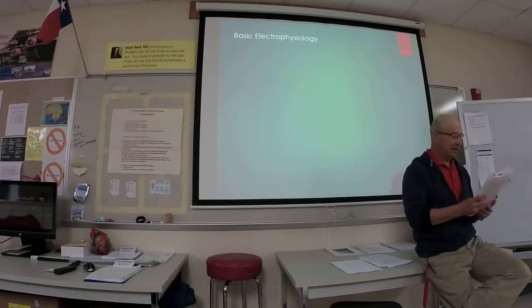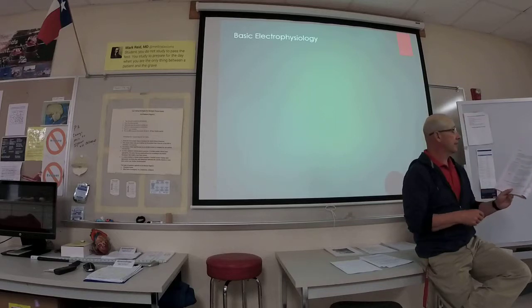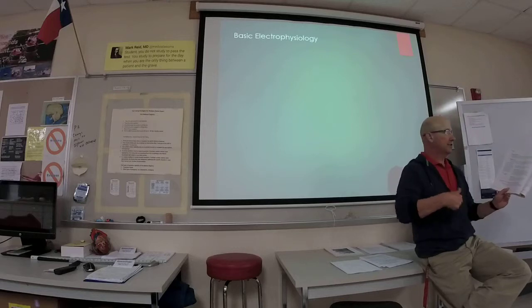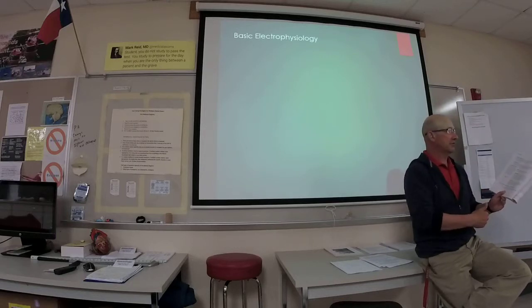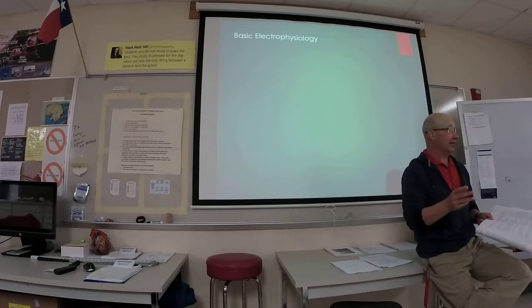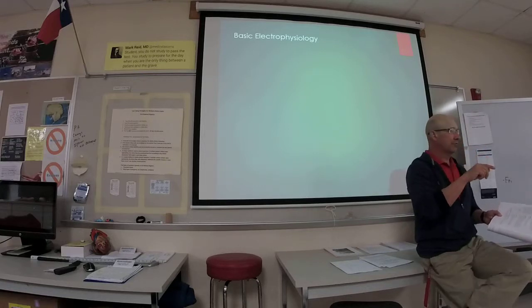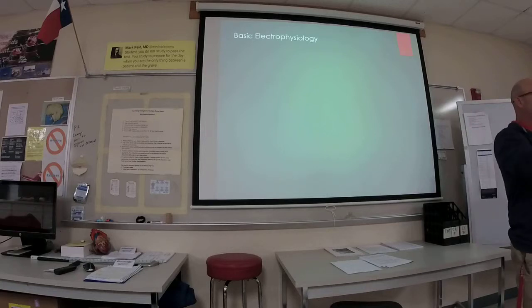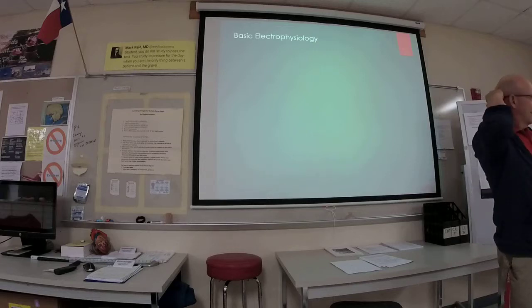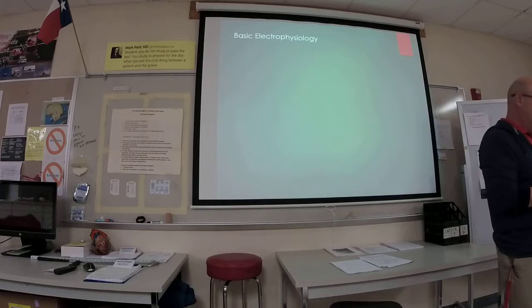We already know about the lead placement, right? This guy's name, however you pronounce it, he came up with it because it's just measuring electrical potential in between two points. That's really all it's doing. Just a little history behind it. EKG started out with an oscilloscope. There were no lines on it, just a little beep. If you look at the really old movies, it's just a little light that beeps up like this. But it gave some sort of waveform to it.